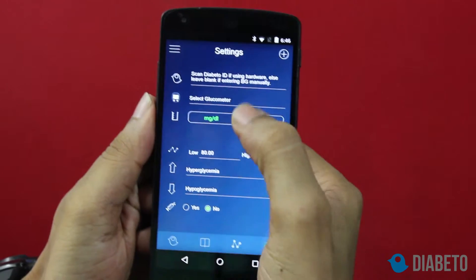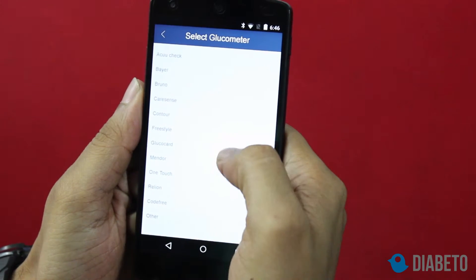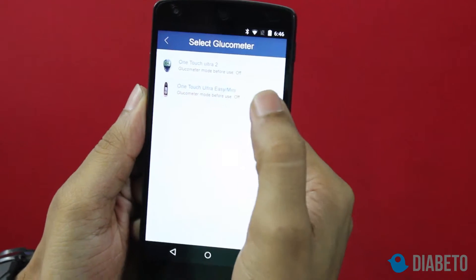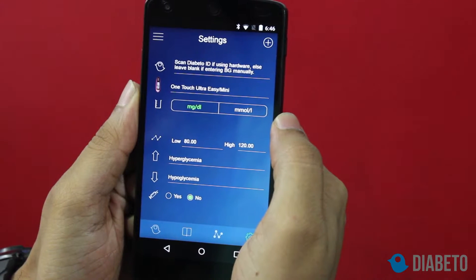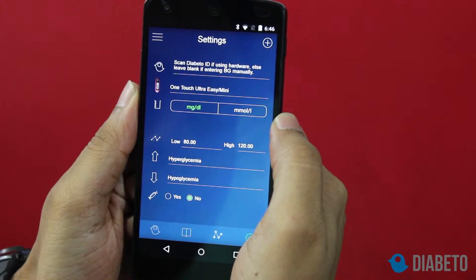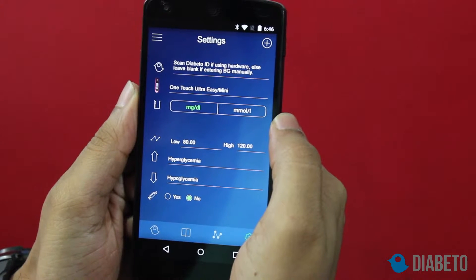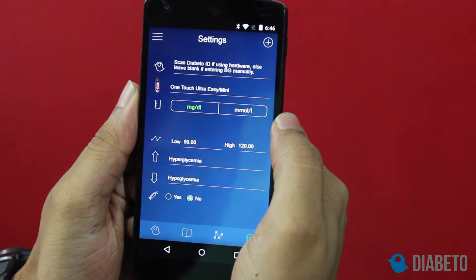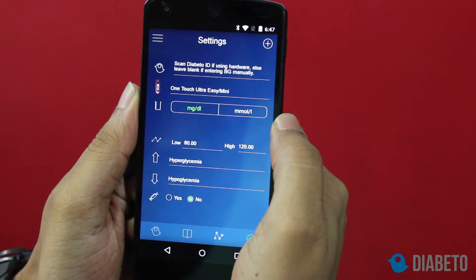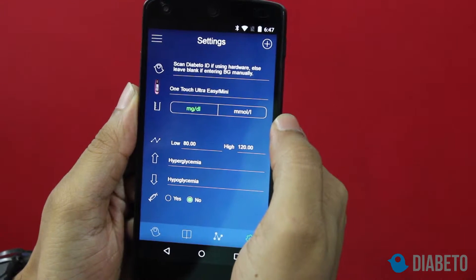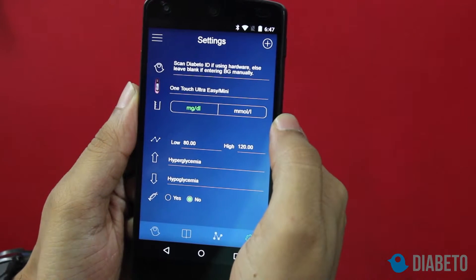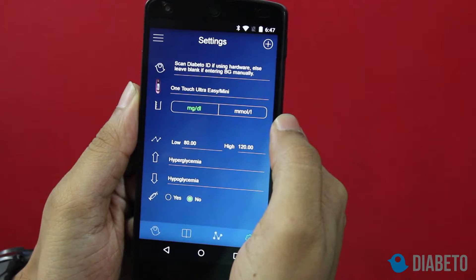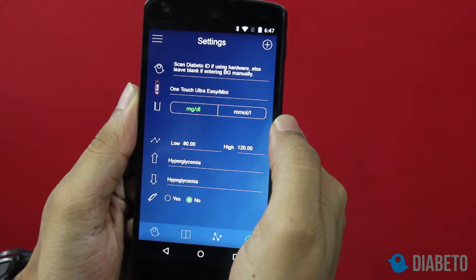The second field is 'select glucometer.' I am using a One Touch Ultra Easy glucometer and that's what I've selected. The third field is your glucose units — I'm in India and we use mg/dL, but if you're in the UK you can select millimole per litre. The fourth field is your desired blood glucose range, which is by default 80 and 120, and that's fine by me.